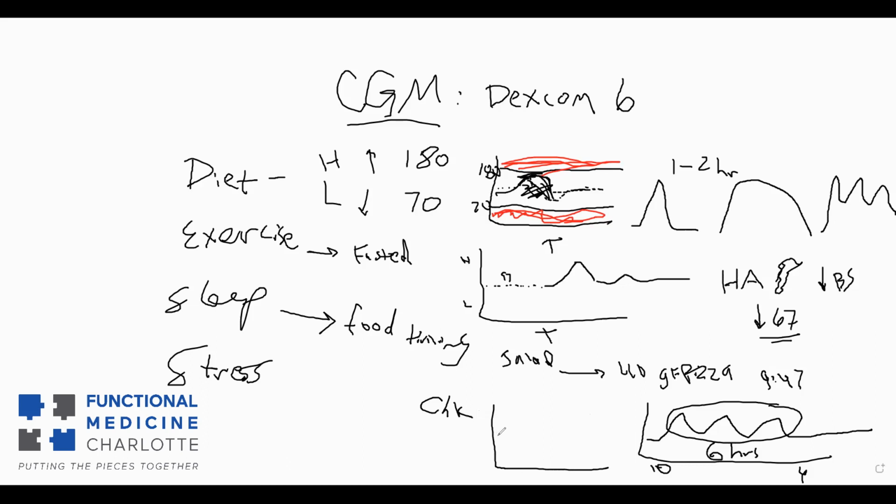So I ate at least 40 grams of just chicken. So it was straight protein. And the next morning I looked at my blood sugar, and over the whole night it was this. Okay, so I'd stayed like 97 to 104 the whole night.